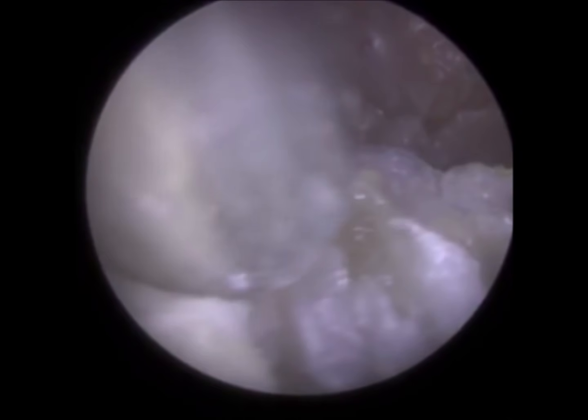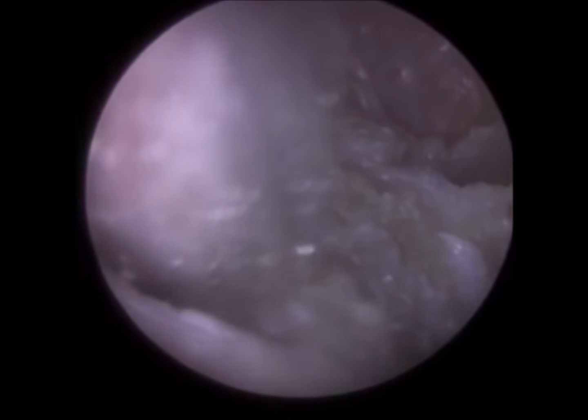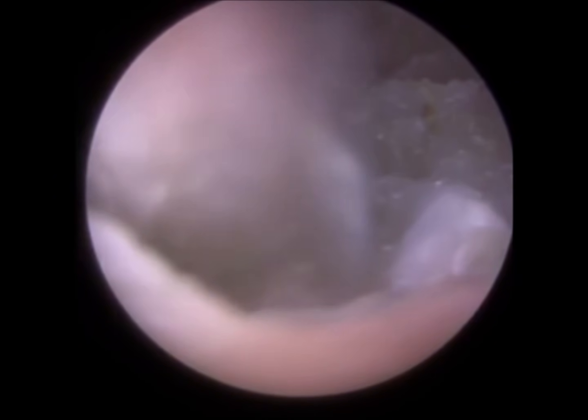You can see just there, just on the bottom left of the screen, a very big buildup of keratin. And this is why an endoscope is so amazing, because of the view. If you were using an otoscope, for example, or even head loops, any other device, you need to use a speculum. A speculum is like a little funnel that specialists put in the ear, and this funnel is probably about a centimetre in depth, and it narrows. So you can quite easily miss some of the surrounding structures, and with an otoscope and microscope, you just don't get the same field of view as an endoscope. And this is why an endoscope is so amazing, because you'll see parts of the ear that you wouldn't normally see with other visualization techniques.